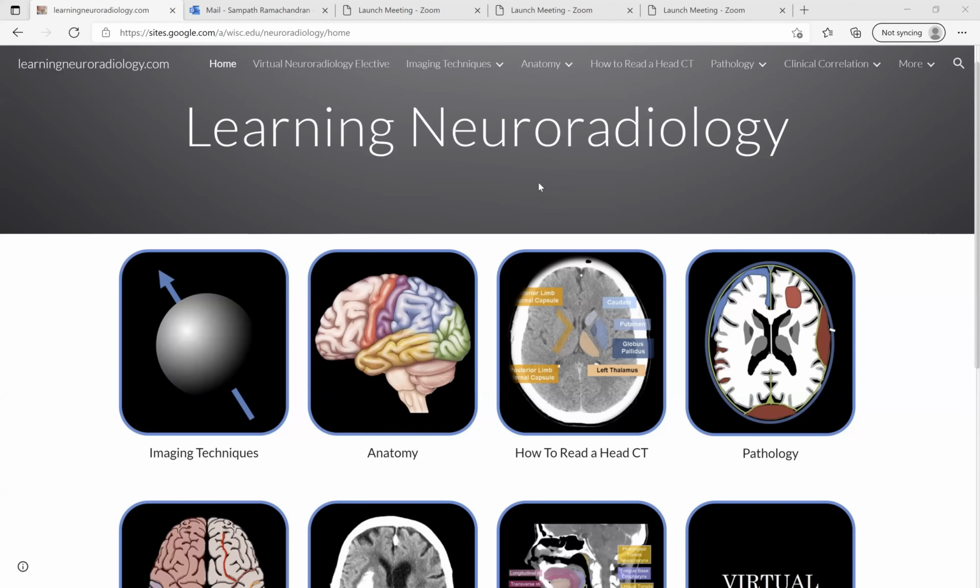Thank you for giving me this opportunity to talk to you guys today. I will try to make it as easy as possible. First, I want to give you a brief description of the basic anatomy. I'm pretty sure some of you have seen a lot of the basic anatomy of the brain, and then I'll take you from there to how we look through the lens of a CT, and what kind of applications we use the CT for in terms of imaging pathology.